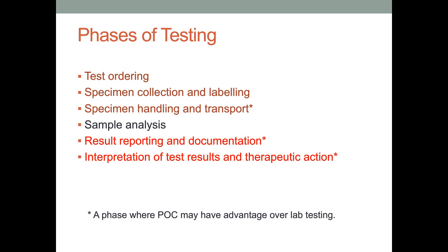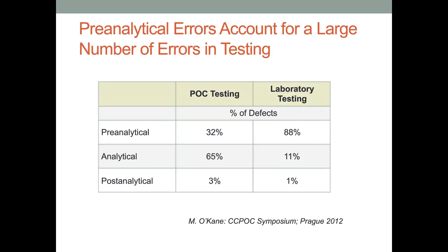Pre-analytical errors account for a large number of errors in testing. Data from a 2012 Prague symposium highlights differences between point-of-care and laboratory testing. The majority of point-of-care testing errors are analytical, but about a third are pre-analytical. With laboratory testing, analytical errors are fairly small, but approximately 88% of a very small number of overall errors are pre-analytical. That does not mean 88% of lab tests have pre-analytical errors — just that most errors in lab testing, when they occur, are pre-analytical.